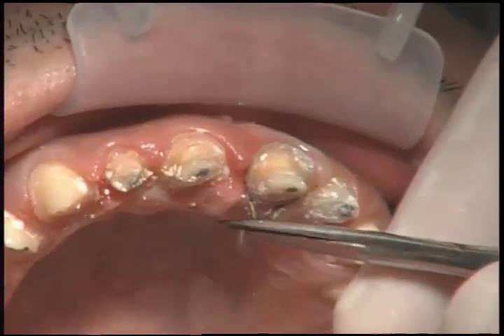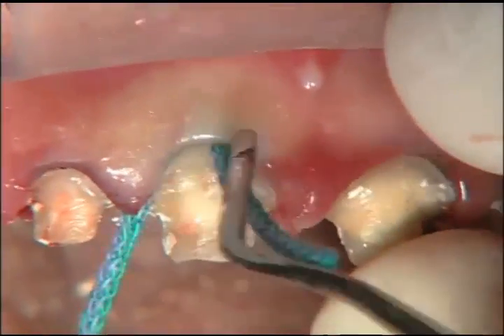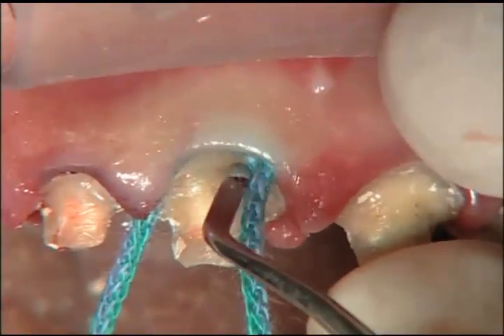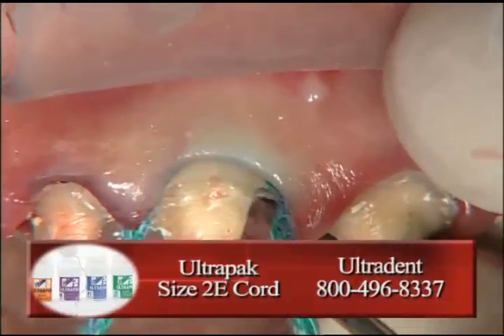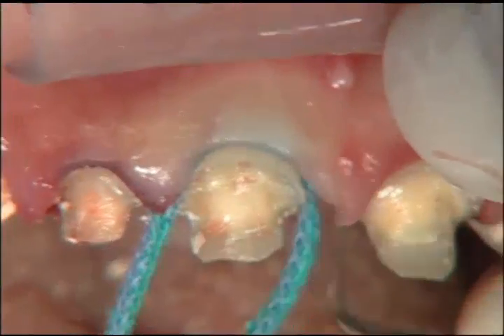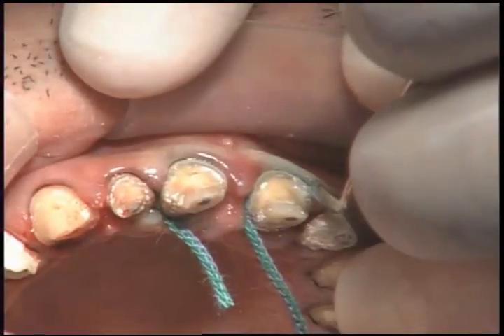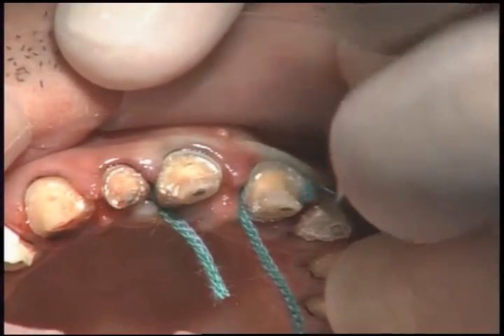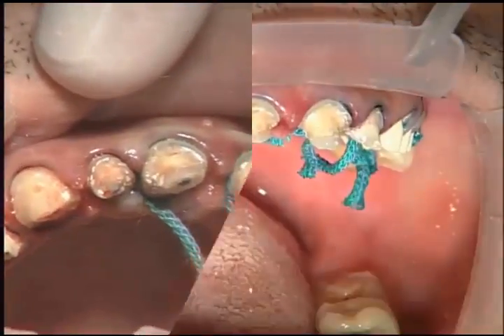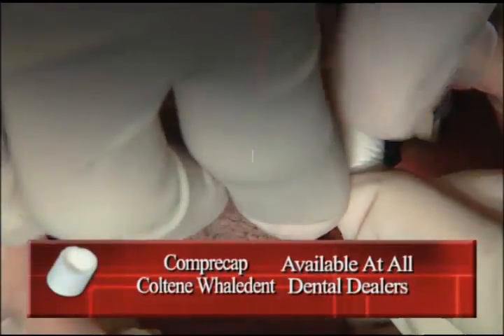Now we're going to go around all these teeth and place a double-zero cord. Once the double-zero cord is in place, we'll go ahead and drop down any margins that need to be dropped to this new tissue level. When this cord is out, that will give us a margin that's about half a millimeter subgingival. We are now placing a number two E cord on top of the double-zero cord around all these teeth. These cords are both from Ultradent — they are hollow cords that expand once they're in the sulcus, making them a lot easier to place and probably a lot less damaging to the tissue because you don't have to use as much force.